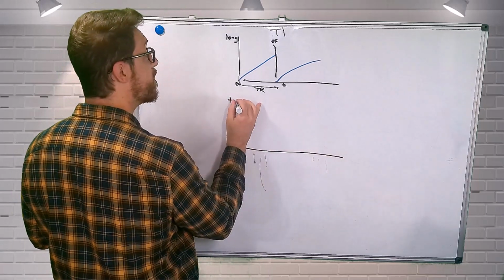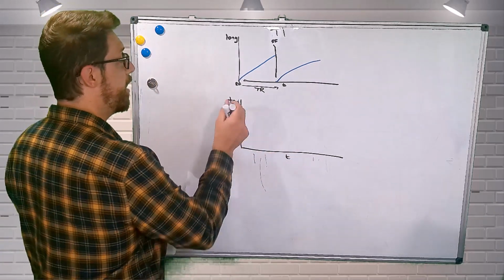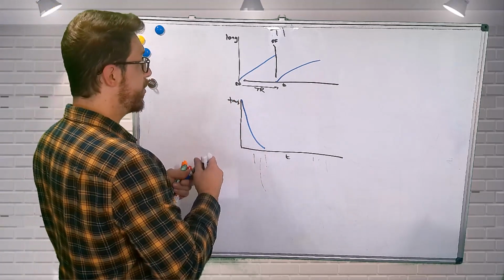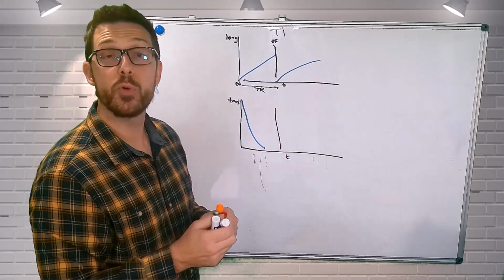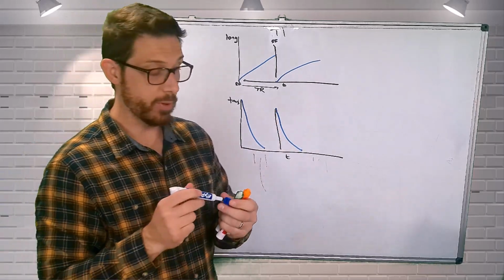The transverse magnetization over a given period of time, we increase that and lose that very rapidly. When we give another TR, we shift those protons in the transverse plane again, lose that signal, so on and so forth.